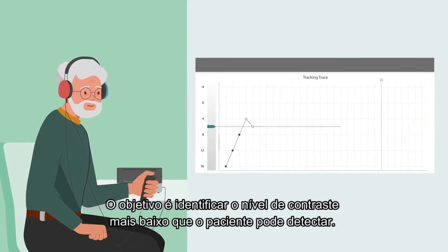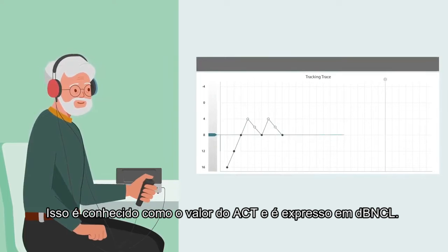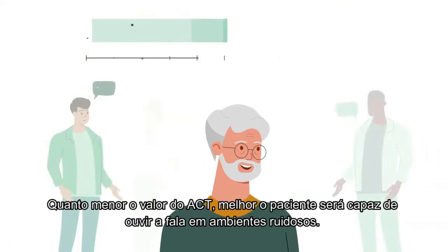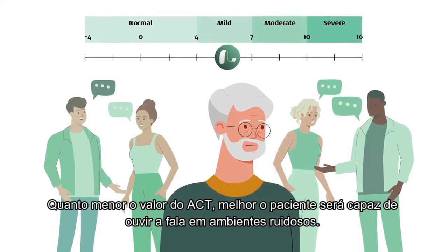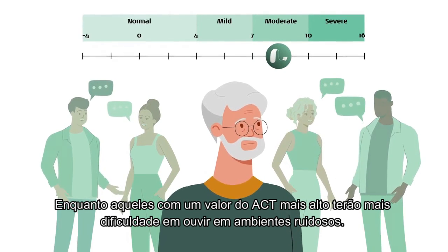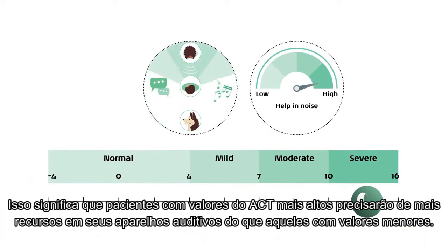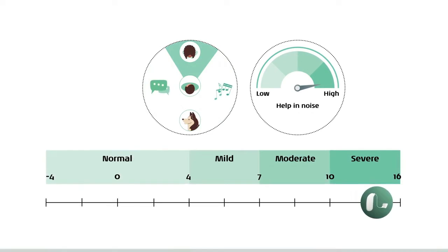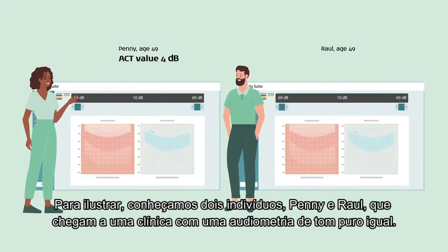The aim is to identify the lowest contrast level the patient can detect. This is known as the ACT value, and it is expressed in dB/NCL. The lower the ACT value, the better the patient will be able to hear speech in noise, whereas those with a higher ACT value will have more difficulty hearing in noise. This means that patients with higher ACT values will require more from their adaptive hearing aid features than those with lower ACT values.